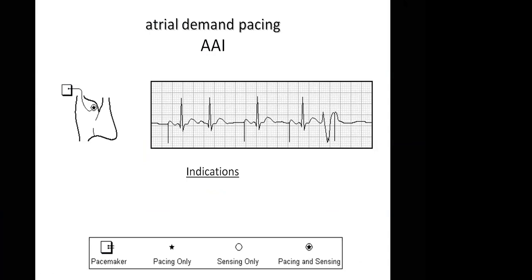Okay, thank you, sir. I'm just trying to emphasize here that you always set the time interval for your pacing. This device paced because when it didn't sense P wave activity, atrial activity, then it has to pace, right? There's also a time interval already set so that if it senses activity, it should not pace. And that's what happened here. This beat came at the expected time that was already programmed on the battery.